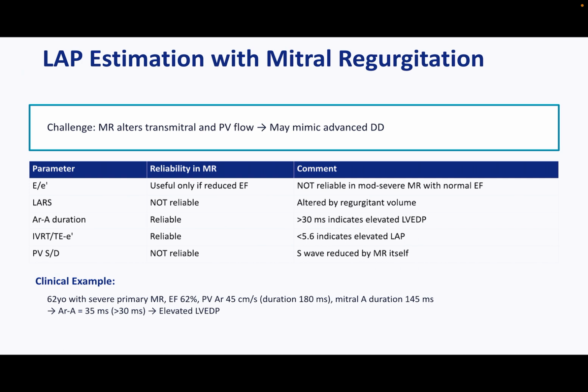In severe primary MR, the decision for surgery is often about timing. If AR minus A duration is greater than 30 milliseconds, meaning LVEDP is elevated, that's evidence of hemodynamic impact even before EF declines. This can sometimes influence the surgical approach.